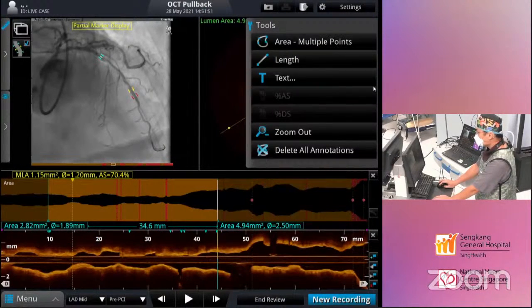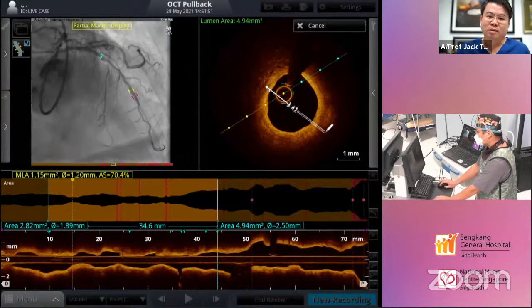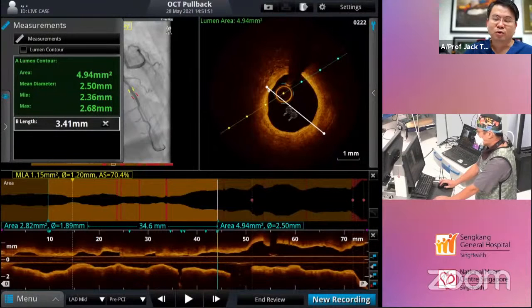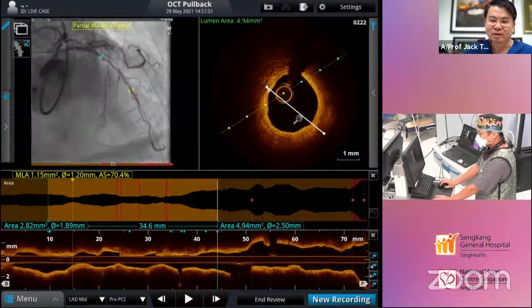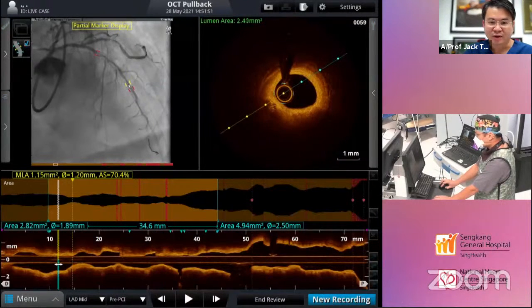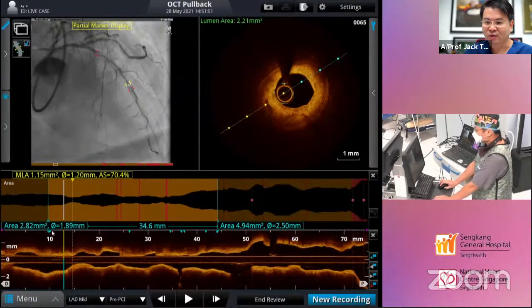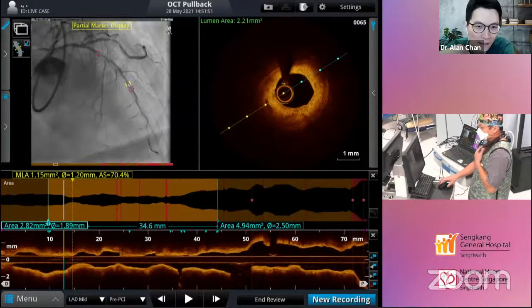In this case, proximal, again, you can't really make it out. Yeah. Anuruck's point is that you should be careful about having too much of a discrepancy. But it was very nicely narrated. Can I ask Alan then, what is your preference? Do you always look at EEL to EEL, or is it sometimes so bad you just look at lumen?